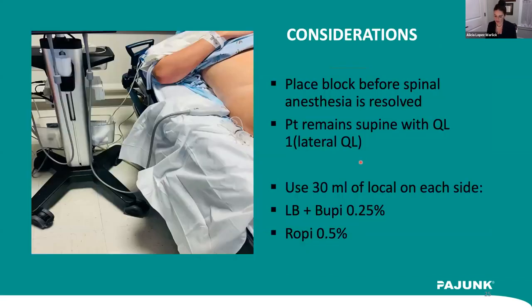So I'd like you to take a few of the notes about the considerations, or I have them here. This is a patient I did recently. We brought her out to recovery room, and this is the setup I used for her in the recovery room in OB. Like I said, place the block before the spinal is resolved. That'll help you a lot. No one will even know you're there. The patient is not bothered at all by it.